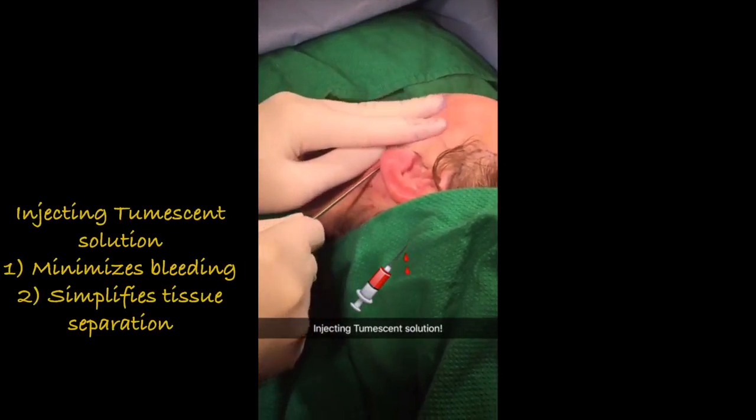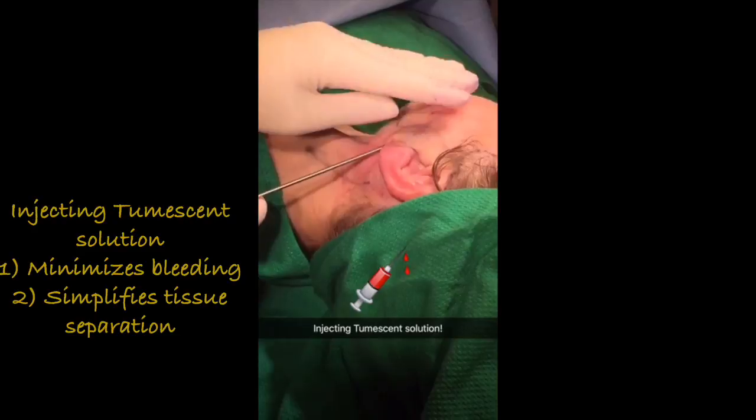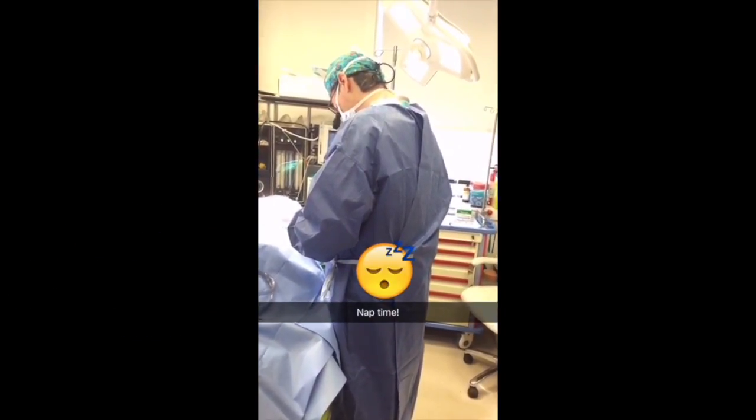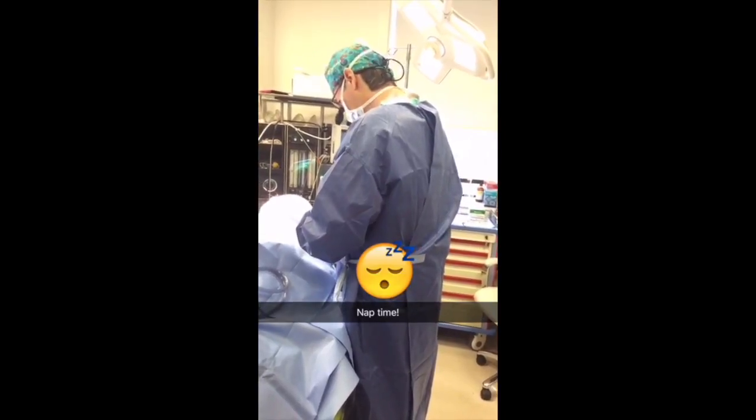So I'm just injecting some tumescent solution. I want you to get a nice nap — close your eyes. We'll do all the work, just sleep.